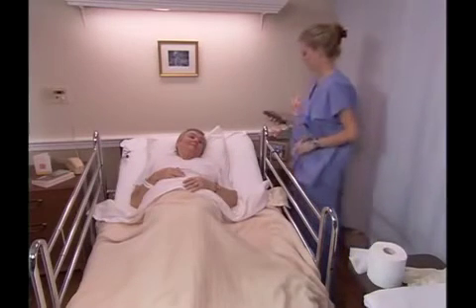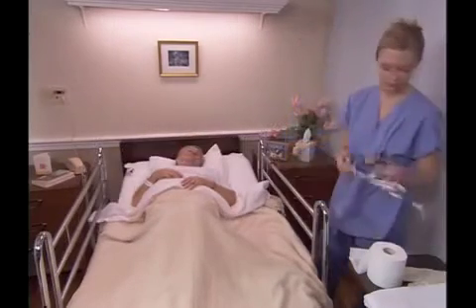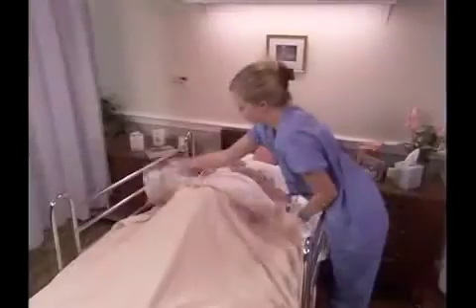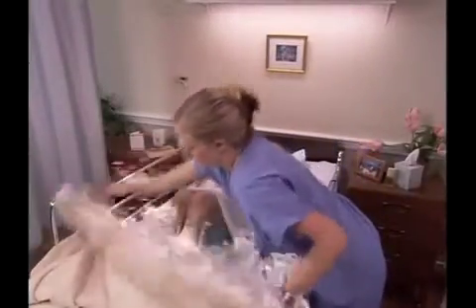Lower the head of the bed as tolerated. Put on a clean pair of gloves. Fan fold the top linens to the foot of the bed. Next, you will remove the bedpan from beneath the person's buttocks.